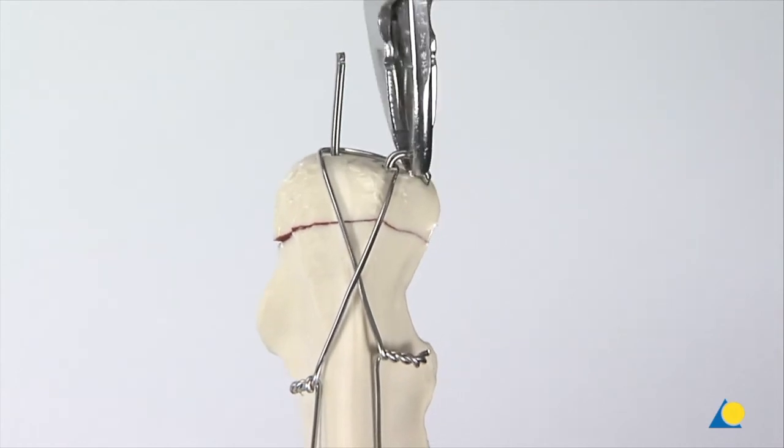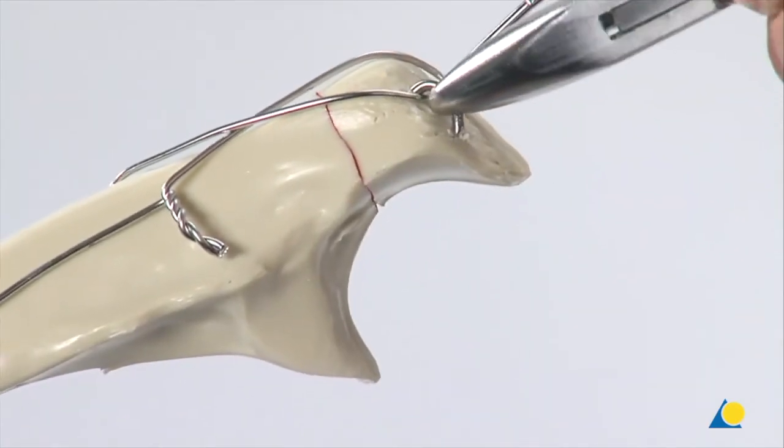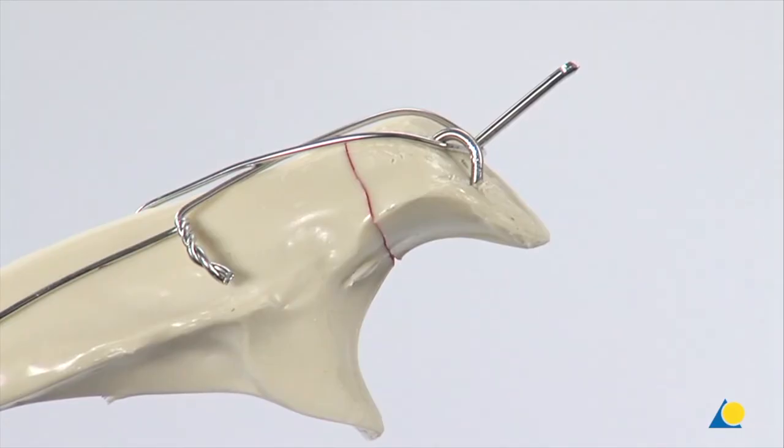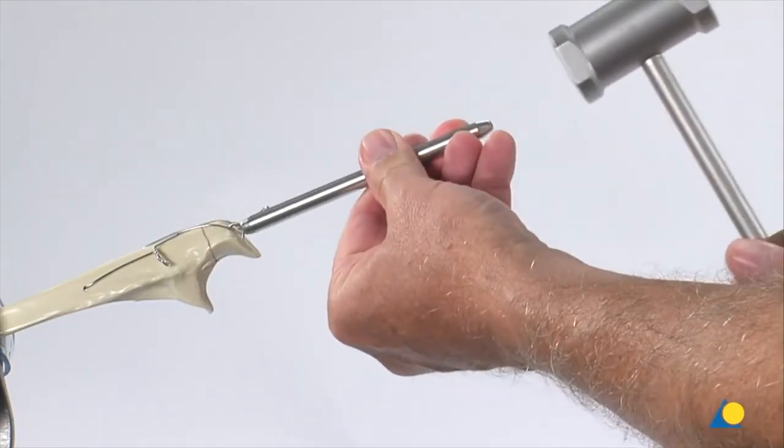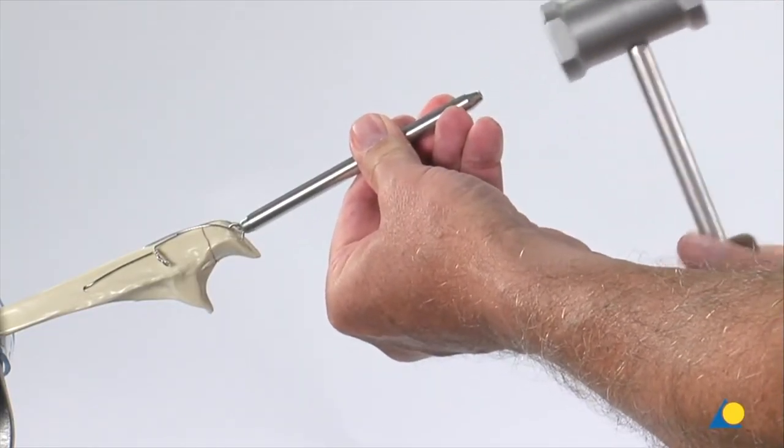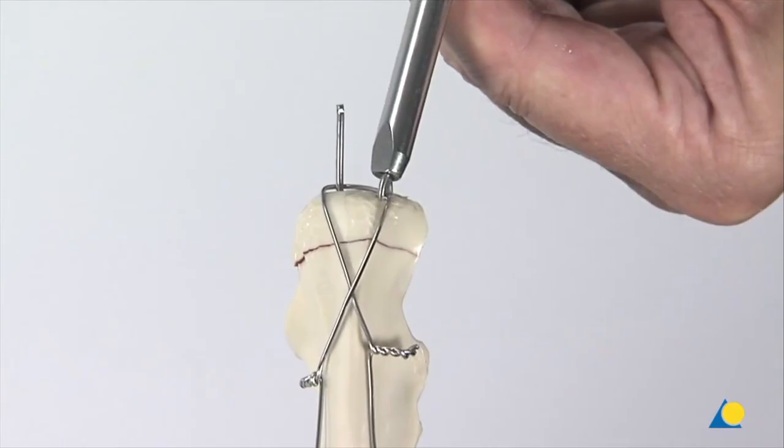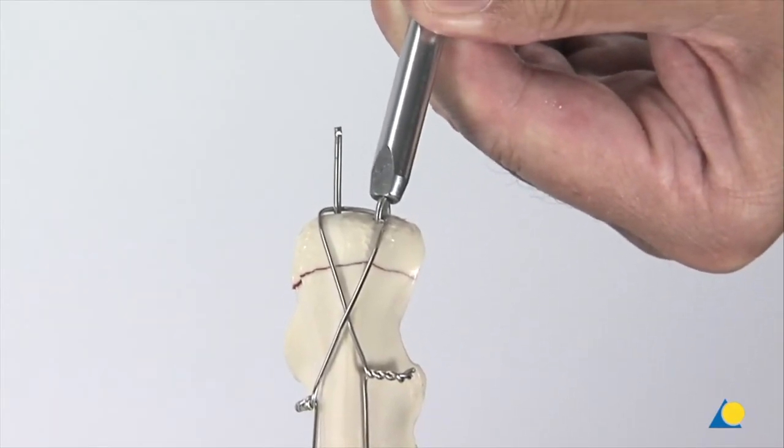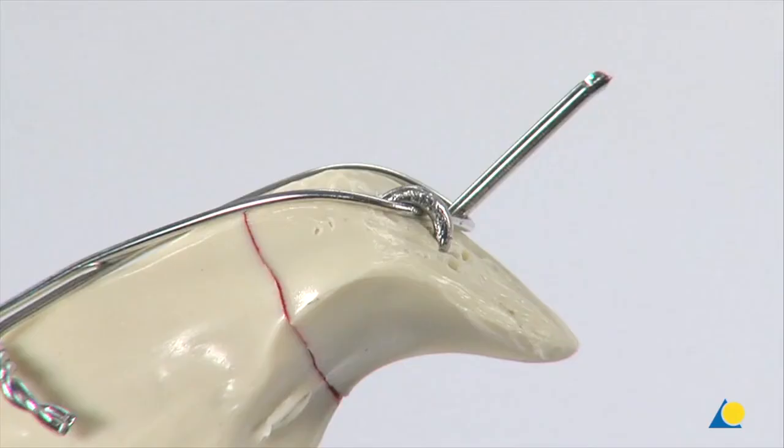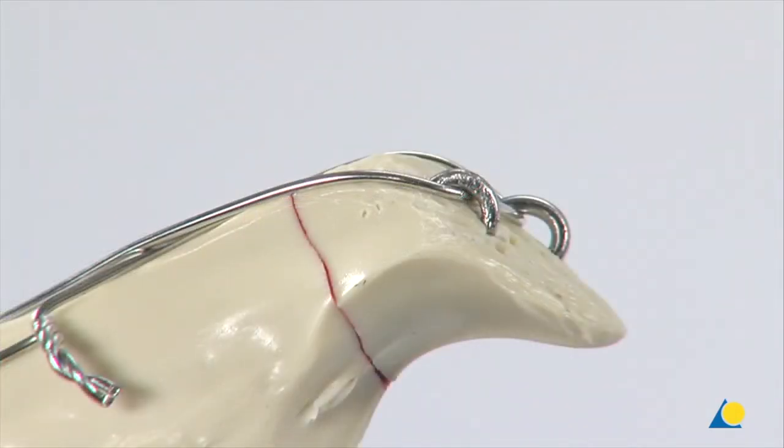The wire is rotated so that the cut end of the wire is lying on the posterior aspect of the olecranon. Using the bending iron and the hammer, the K-wire is impacted into the olecranon. This procedure is repeated for the second K-wire.